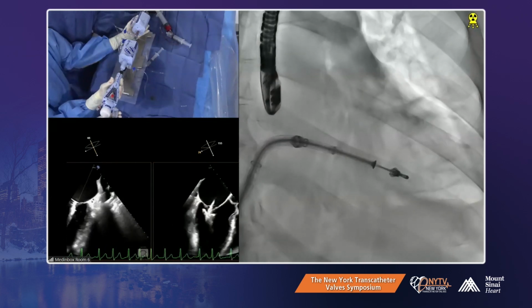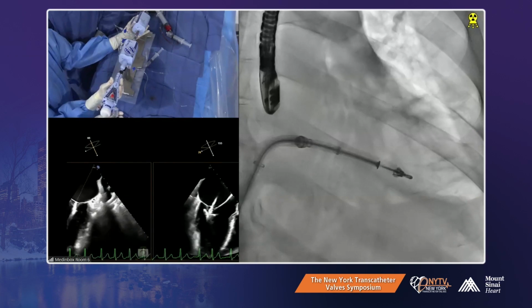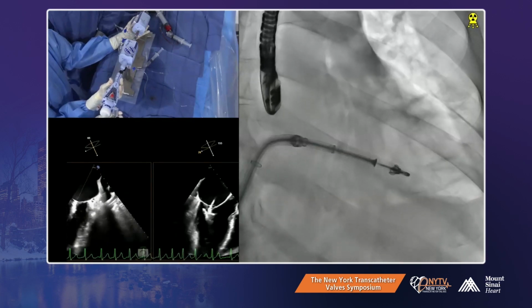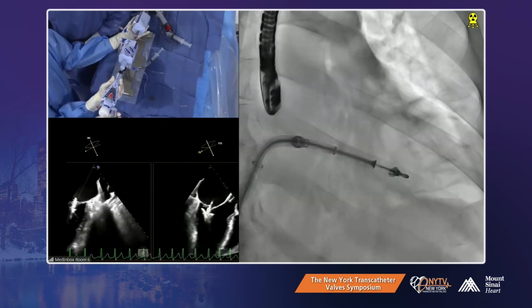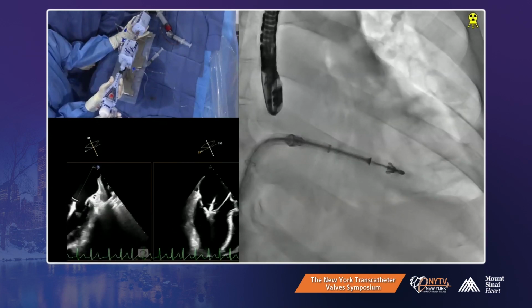I think this may be an opportunity to lower the anterior gripper and then go posterior. Slightly posterior and advance. Yeah, the anterior gripper is actually down. We have lowered the anterior gripper. Okay, this is great. Now we are going posterior.